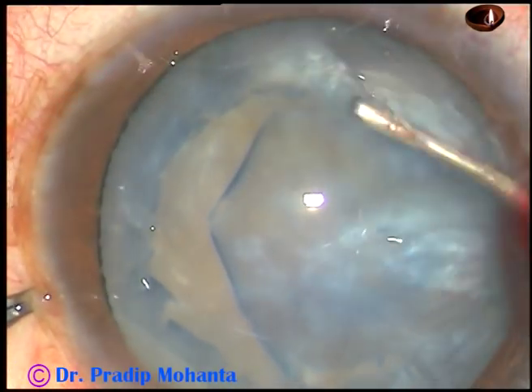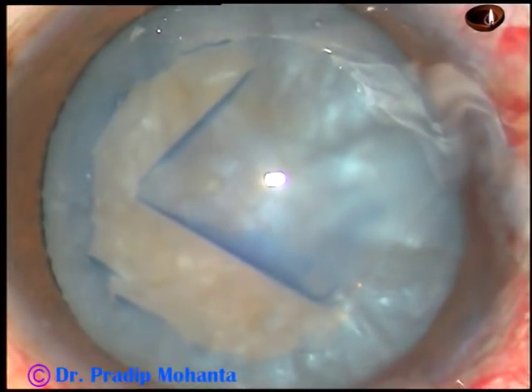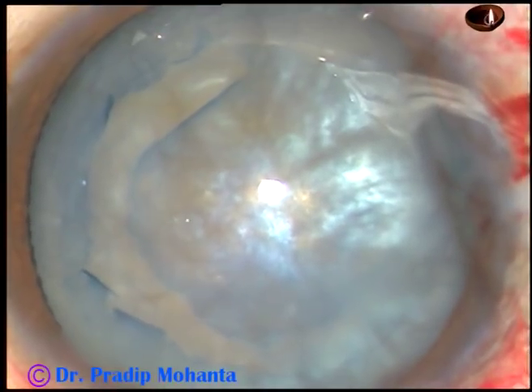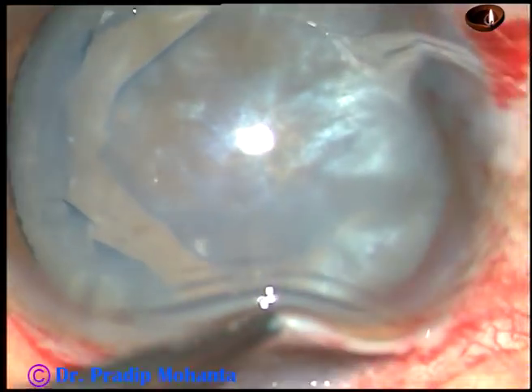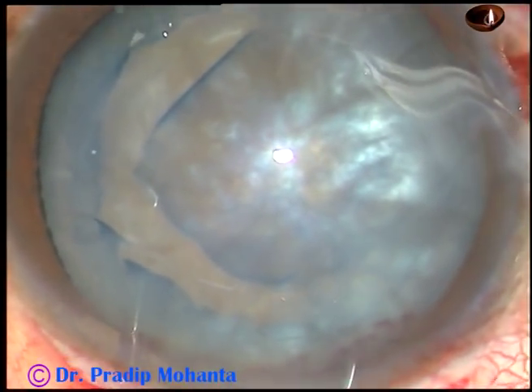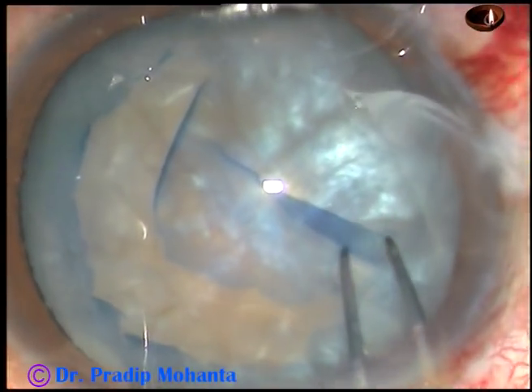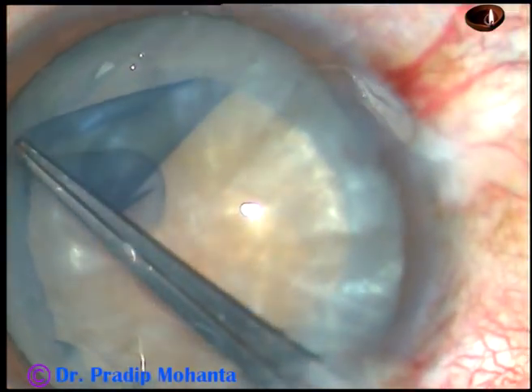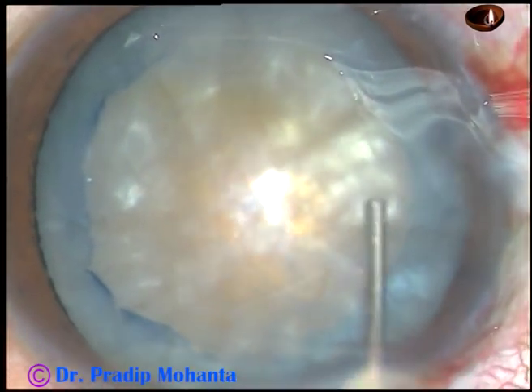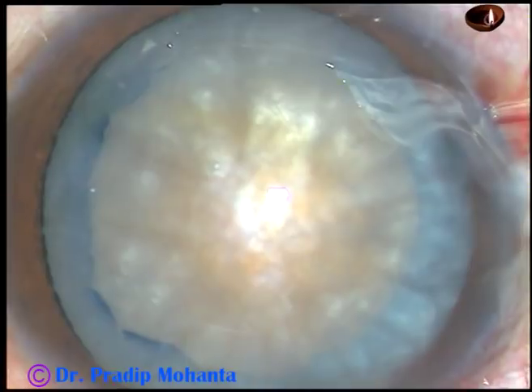We have done can opener capsulotomy in many cases in the 90s. Inject some more viscoelastic substance. Take the keratome and just enter into the anterior chamber and come out — so you have a 2.8 mm entry. Hold this capsular tag and guide this tag and tear it off. In this case, you have done can opener capsulotomy for about two-thirds and one-third is use of rhexis force.